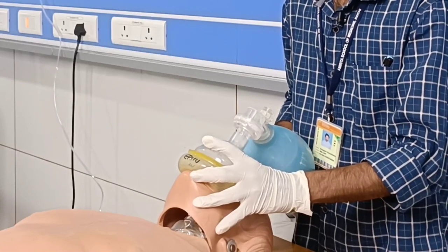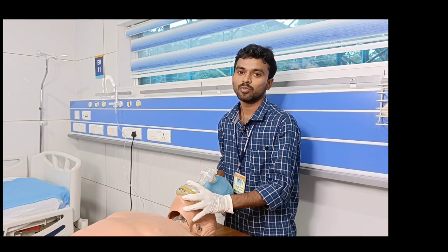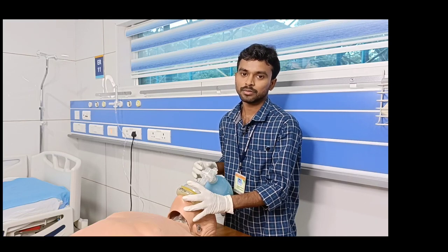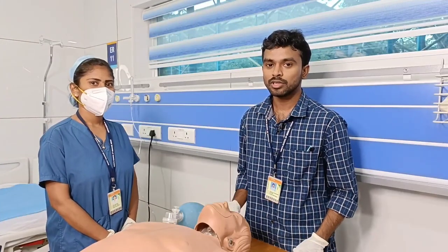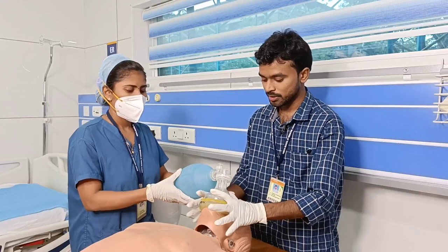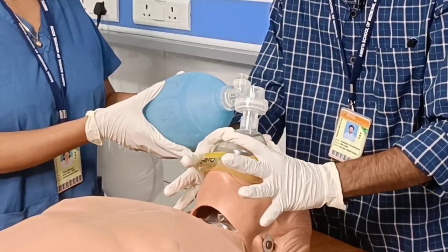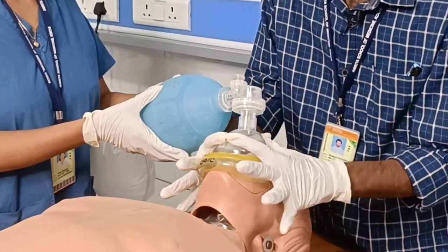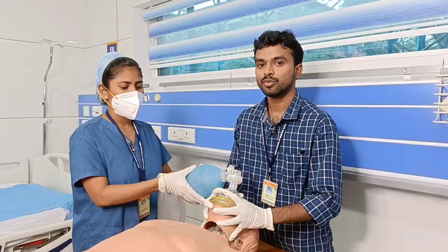In two-hand ventilation using the two-C technique, one person holds the mask with both hands — each hand forming a C-shape on each side of the mask — while the remaining fingers lift the jaw on both sides. A second person squeezes the bag and delivers breaths. This is two-hand ventilation.